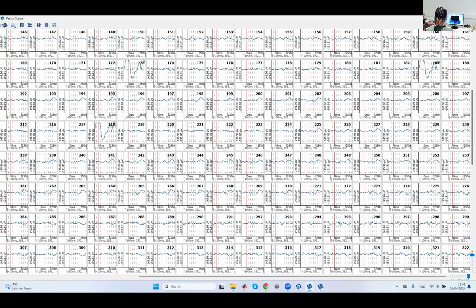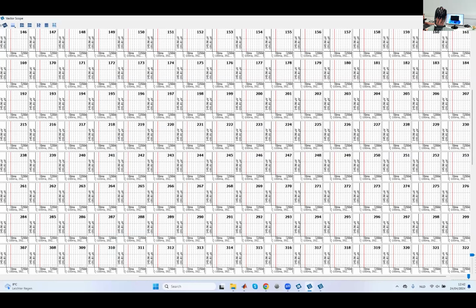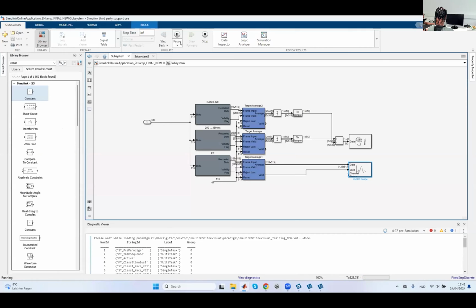Here you can see a nice peak, and we use these channels, we feed all of the 512 into the experiment. So what I'm going to do now is run it again and show you these topography maps online that we just talked about.